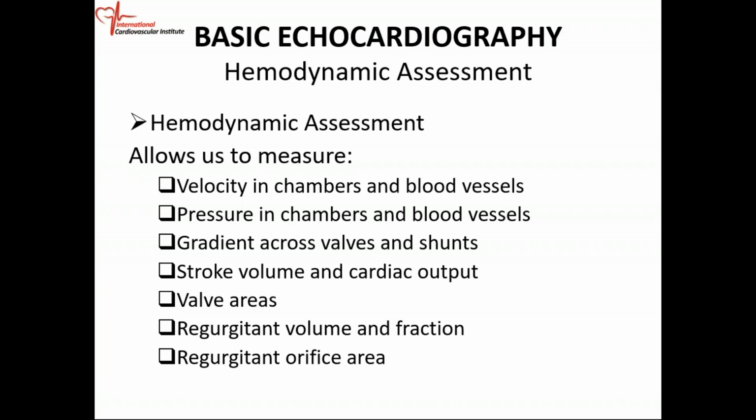We have a lot of patients with aortic stenosis and some with mitral stenosis, but today, when we evaluate someone with aortic stenosis, we don't need to take them to the cath lab to do a valve area. We can do that in the echo lab. So we can fully assess the aortic valve, looking at the valve area, the gradient, and stuff like that.